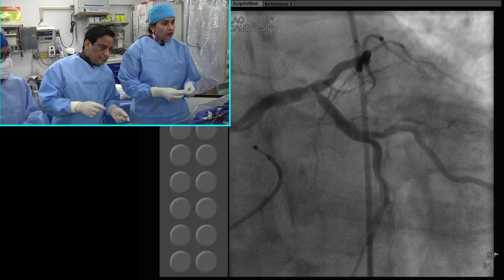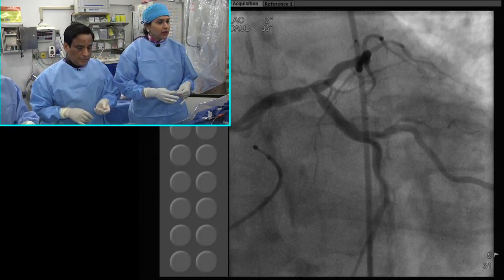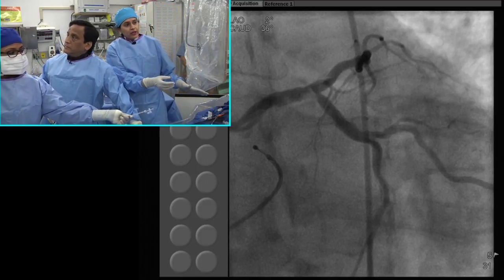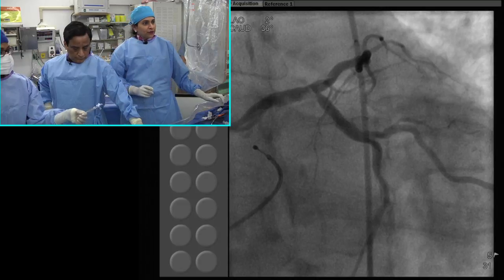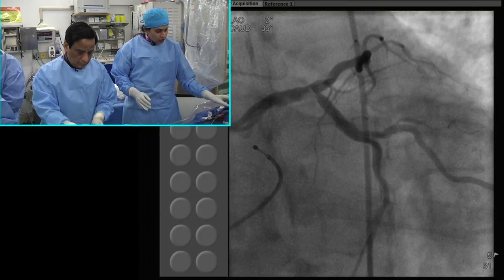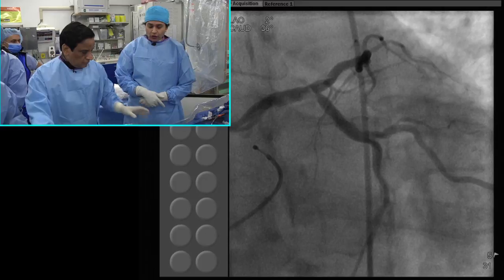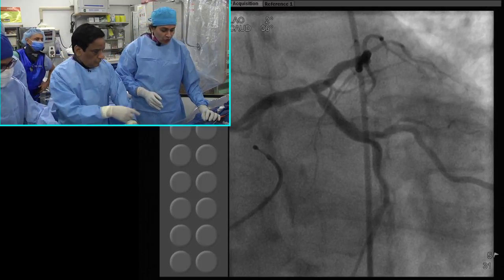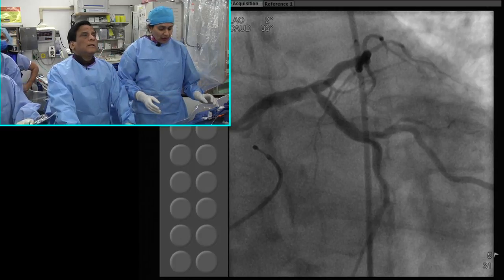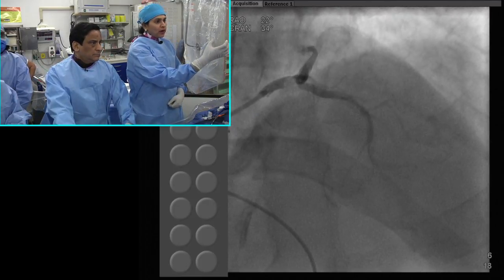Going back to the point here, Samir, you asked why we selected rotational atherectomy and not orbital atherectomy. Can you see the angiogram I have just? Yes, we can. So you see how eccentric the lesion is, in the distal left main extending into the circ. We did an OCT study and published it in CCI: if you have a calcium arc, which we also saw in the IVUS, of two quadrants, then when you are doing orbital atherectomy, the wire bias is higher in this kind of situation. That may be one reason why we do not want to do orbital atherectomy.